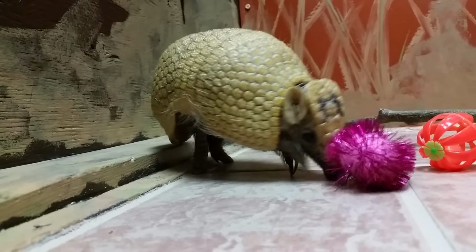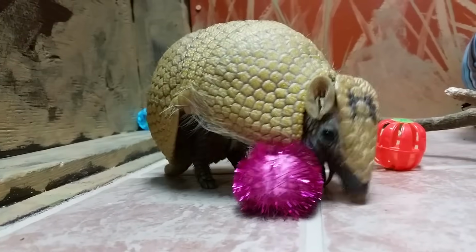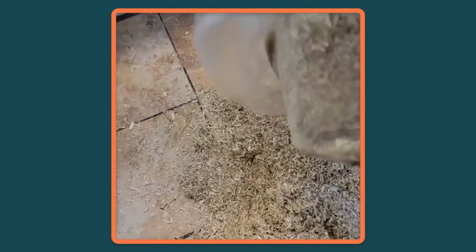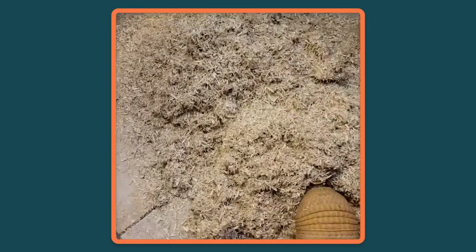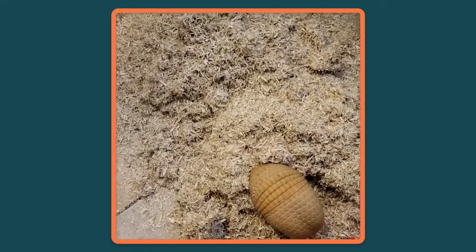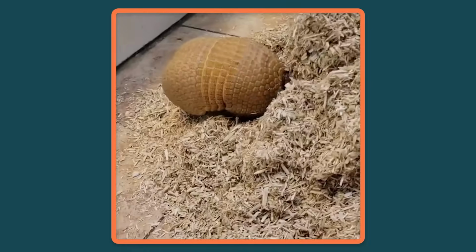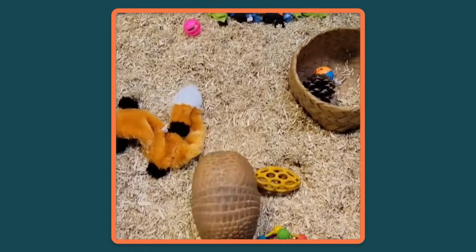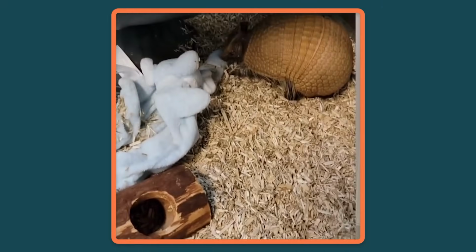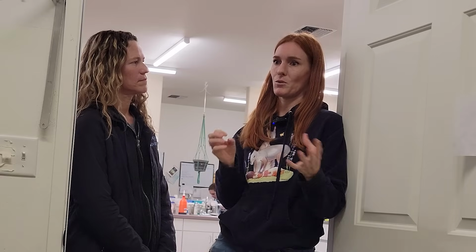And so now we know that she doesn't have a baby, which is kind of what I was expecting. Were you kind of hoping that she would have a baby, or how'd you feel about it? I was fine with either outcome. I just wanted it to be a successful procedure. So their gestation is 125 days, and at about 120 days, we'll do this again and just see what's going on. The reason we want to know is we don't want her to have a baby and have Kinchu in the same area, because sometimes the males can be aggressive towards the babies. So if we do see a baby growing inside, we can separate her and Kinchu.